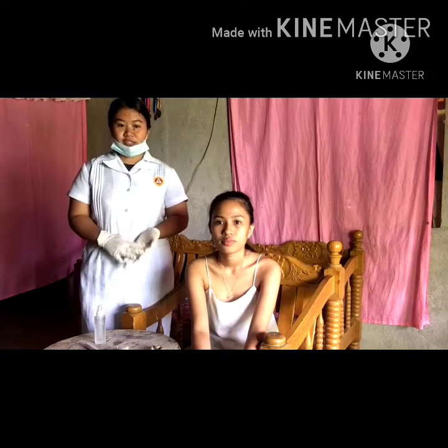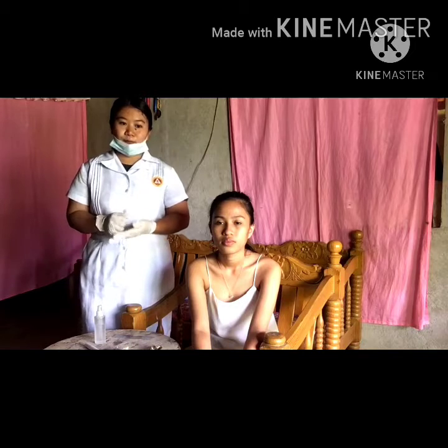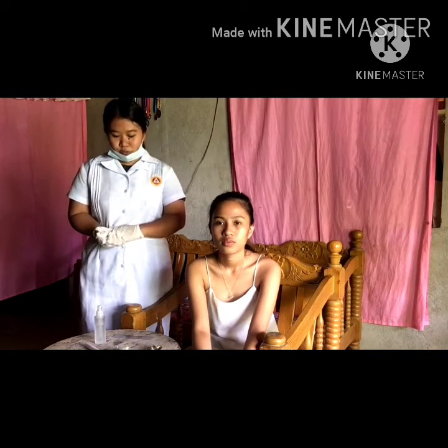For procedure number 5, we inspect the tympanic membrane: the color, consistency, and landmarks. For the normal findings, it is pearly gray or shiny, and it shows movement. And then for number 6 is auditory function, using whispered words.